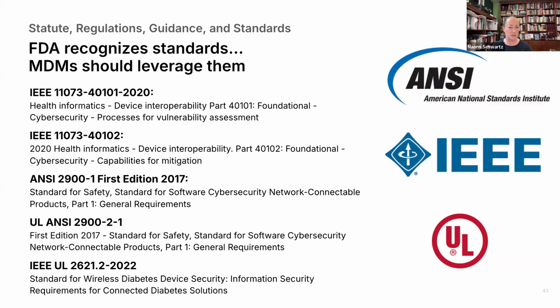There are 11073 standards that apply to personal healthcare devices and point of care devices that attempt to lay out how to engage in interoperability and how to secure those interoperable elements. Some manufacturers use these heavily, others don't use them at all. But the Bluetooth SIG, the special interest group, has implemented Bluetooth specific versions of these standards. These are protocol agnostic, so that there's actually an opportunity to leverage Bluetooth SIG services and profiles to describe how your Bluetooth device functions and interoperates with other things in its ecosystem. It is really, really a good idea if you're considering using Bluetooth to look at the Bluetooth SIG.